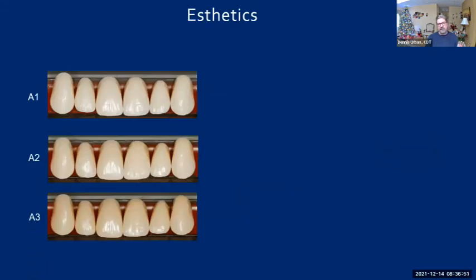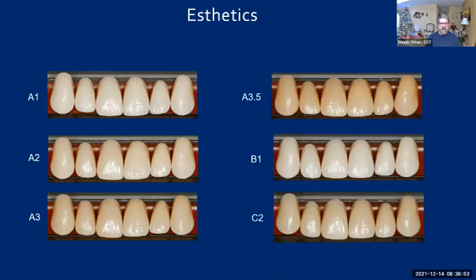They're very aesthetic. Matter of fact, I want to let you pick out which side. We have denture teeth on each side. I'm going to draw a line through the two centrals on each side. You tell me which one is the printed and which one is the carded teeth. Okay, I drew the line in between here. Take a look at them. See if you can tell which is milled or carded.